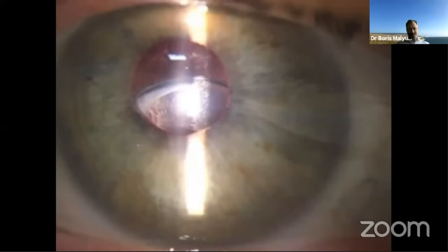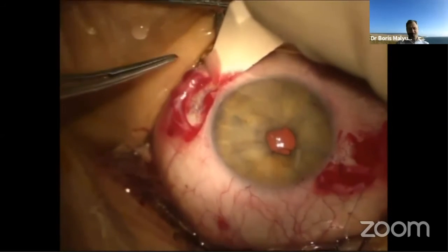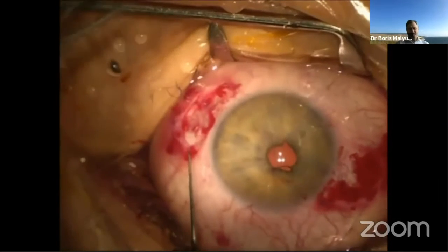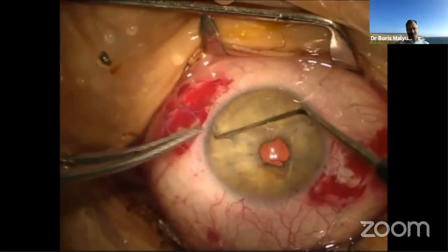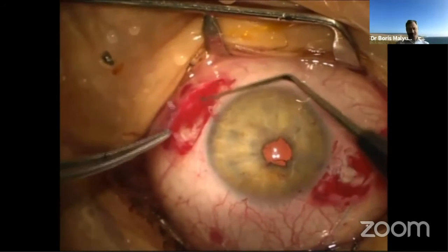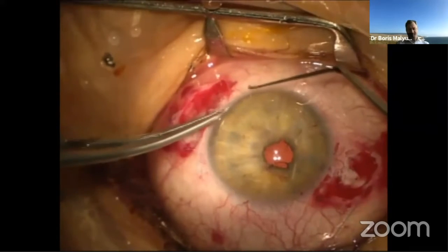However, 2 years ago, a patient came back to us 5 years following implantation of the CTR and suturing it to the sclera. You can see here that the IOL is dislocated. The suture is located under the conjunctiva, and during the surgical procedure, when we inspected the area of the suture, we observed that there was a suture break that happened over these years. This patient needed refixation of the capsular bag with another suture, and this problem was resolved.